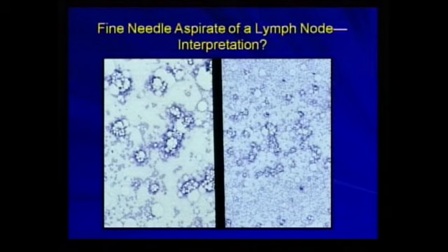Generally in universities, there is a clinical pathologist, or in Europe, an internal medicine specialist who have done lots of aspirates, and rarely do you get this. But what we're looking at is aspiration of the fat around the lymph node.